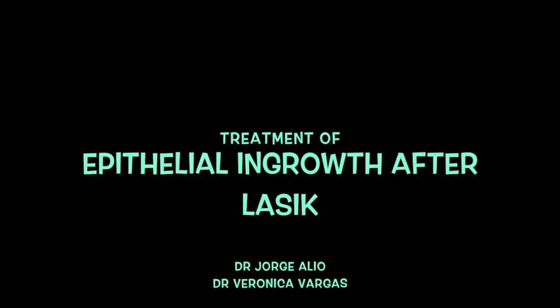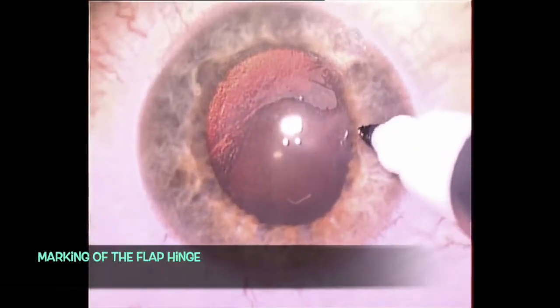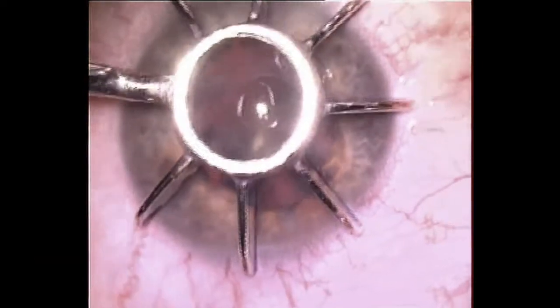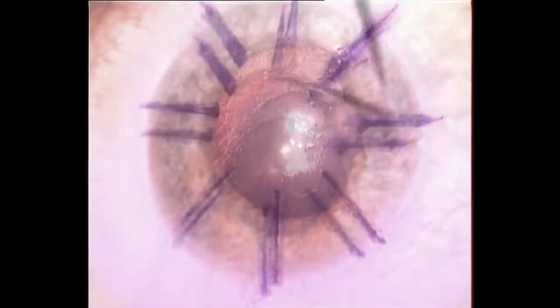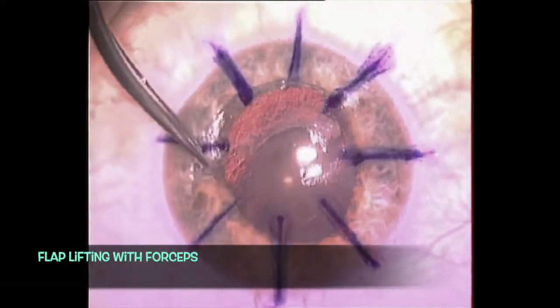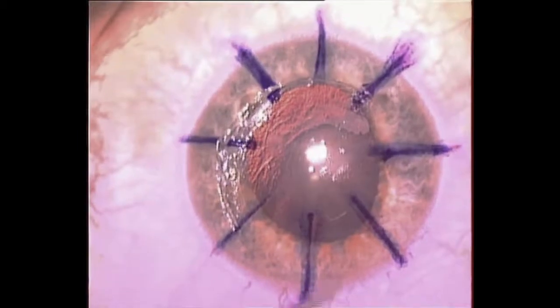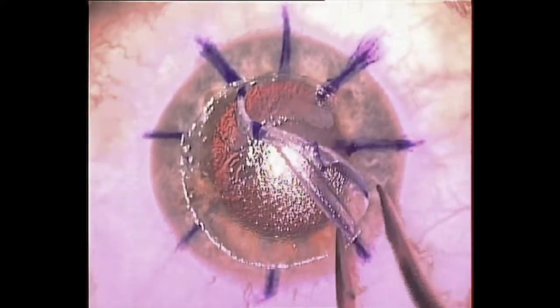In this video, we are going to teach you how to treat epithelial ingrowth following LASIK. This is a case in which, 17 years after a LASIK procedure, the patient suffered a trauma and flap dislocation happened. After two flap relevations and cleaning, the patient ended up with this type of epithelial ingrowth that affected 2 quadrants of the interface and was creating a severe distortion in the topography with important loss of corrected visual acuity.